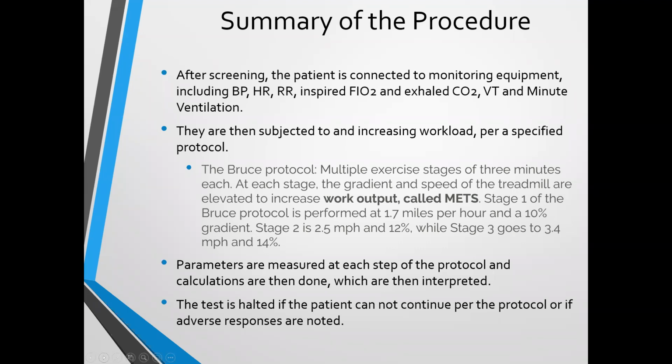There's also the Balke one, which is another one that's out there. So it's not about the actual protocol, but do understand it's not arbitrary. It's actually set in a very precise manner. So if we have, Terry and I have 50 or 60 people in today's, in an average session that we have for our CEUs.